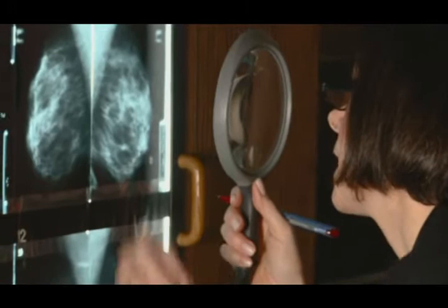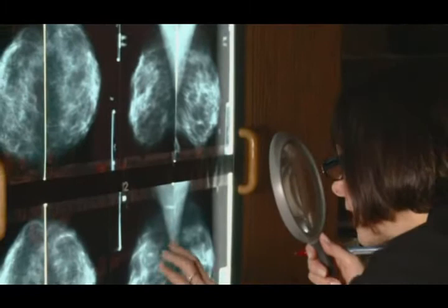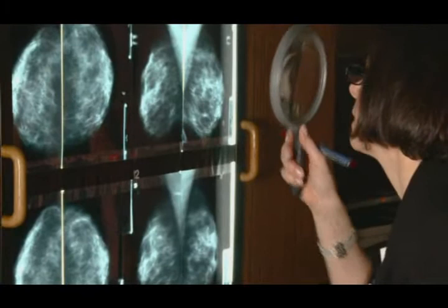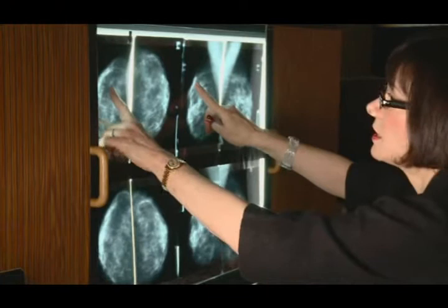There's some calcification here, but it's typically benign calcification, and in fact it's unchanged since the previous — I'm comparing with 2009 here. So the rest of the mammogram is fine. Based on where it is on these two films, I can tell you that it's in the right upper outer quadrant, the upper outer area of the breast.